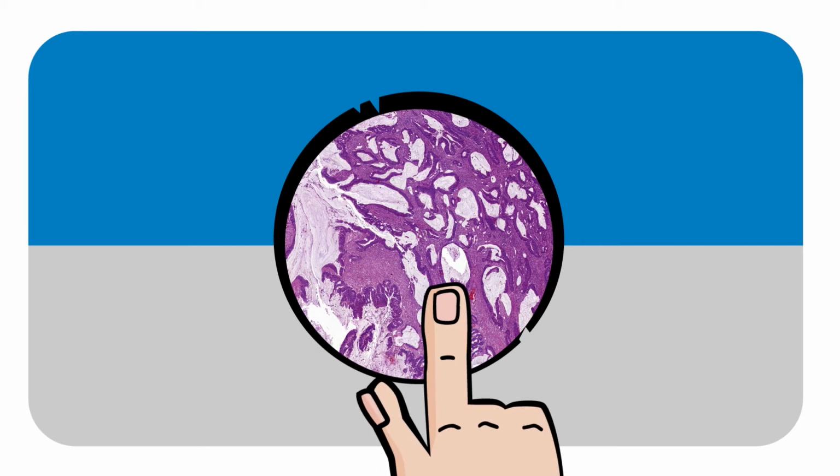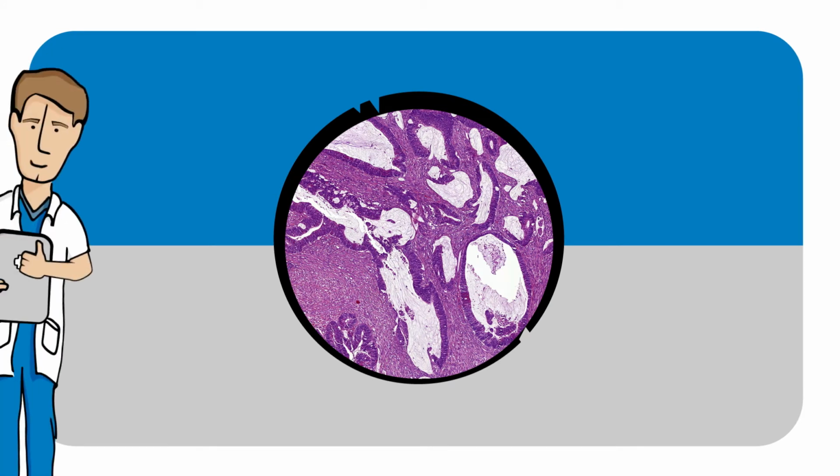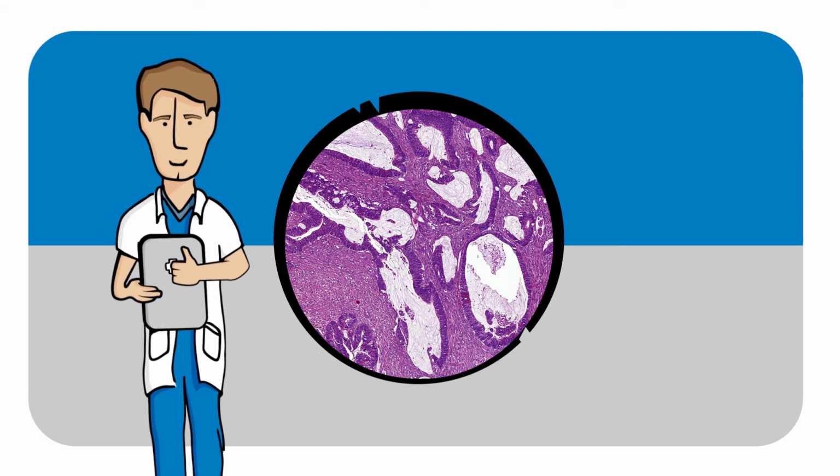Tumours mucinous in nature can be difficult. You may use an area containing mucus. However, you must exclude the mucus when determining the tumour-stroma ratio.